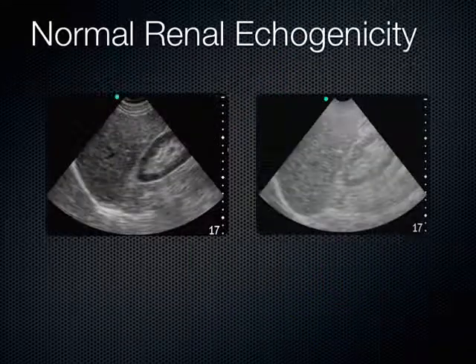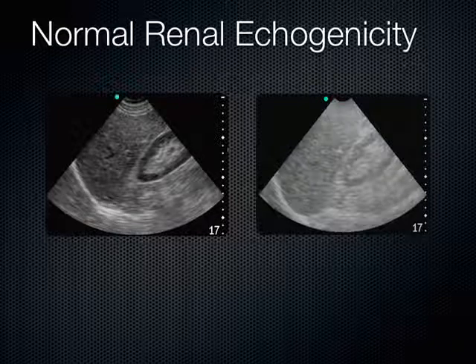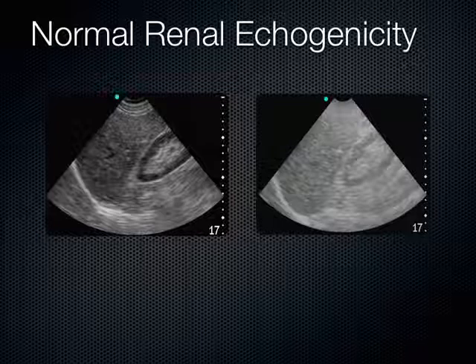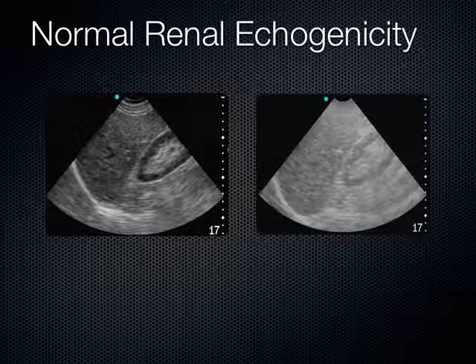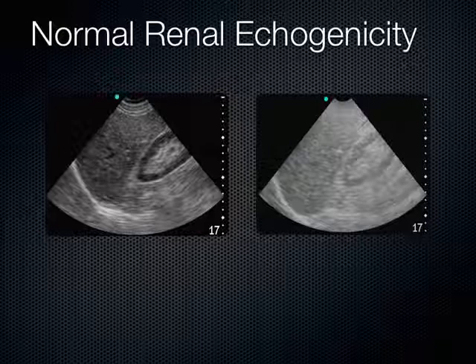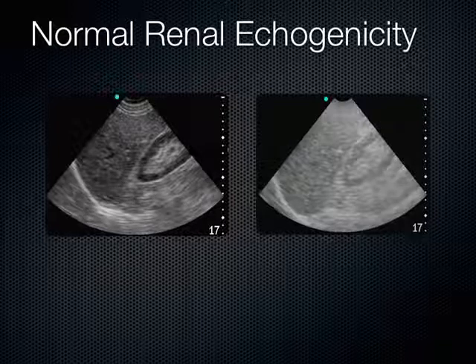Normally the cortex of the kidney is less echogenic than its next-door neighbor — the liver on the right or the spleen on the left. Can you make out that the renal cortex is slightly less echogenic than the liver parenchyma? This is an image that's over-gained. As novices we tend to over-gain the machine to see better, especially in a brightly lit room. Look what happens — you can wash out this image, making it really difficult to see that the cortex is less echogenic than the liver.